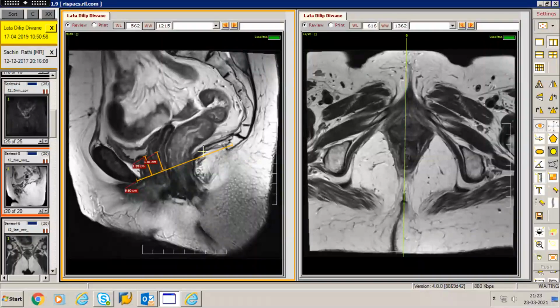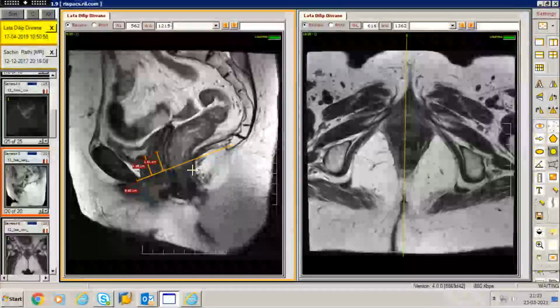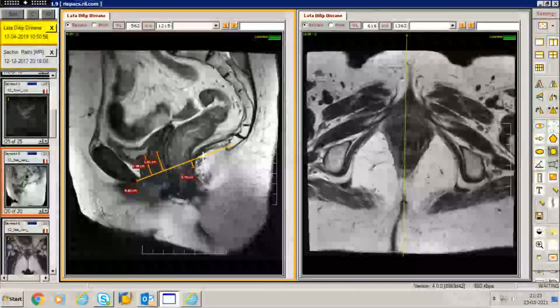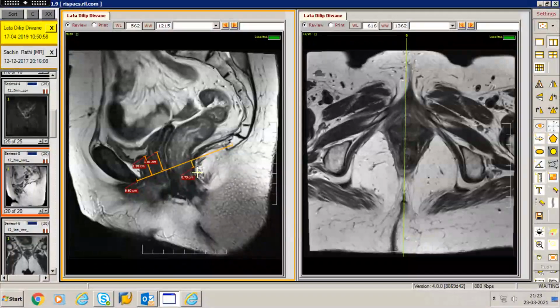At the same time, when it comes to the posterior compartment, we are going to take the anorectal junction into consideration. So for example, we can see again the levator shelf coming over here, the puborectalis joining to form the levator shelf, and where it would join the posterior wall of the anorectum would comprise the anorectal junction. So this is the point, if you can understand, that would be the anorectal junction itself. I would then draw a line perpendicular to the pubococcygeal line, and this is what is called the M line.